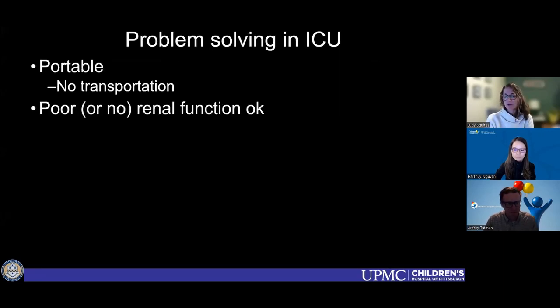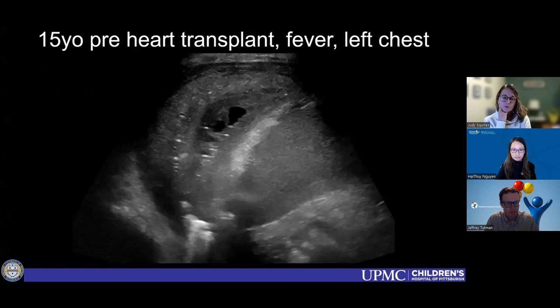The other topic I wanted to briefly touch on, since we only have 10 minutes, is the other area where our volume is almost as big as our liver lesion evaluation volume: our intensive care units. We have our pediatric intensive care unit, our CICU, and our NICU. There are a ton of advantages of contrast enhanced ultrasound in this patient population, who often have renal failure issues and transportation issues. The nurses do not want to pack up all of that stuff to come to the imaging suite. Even with a portable CT or MRI, they have to move the patient at least a little bit. So here are some examples that we've used clinically.